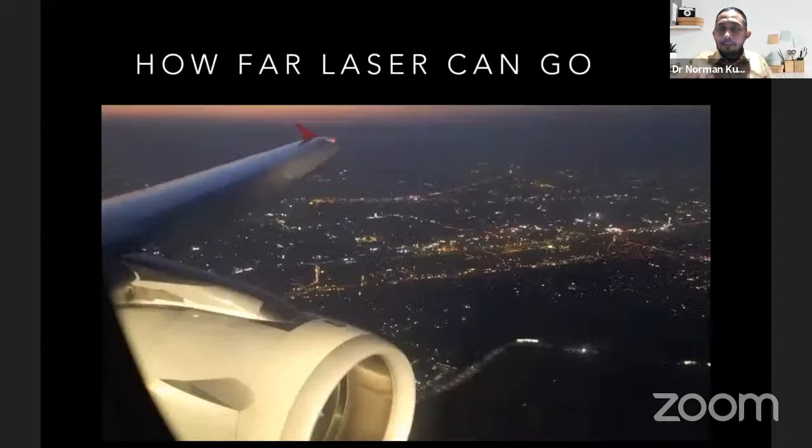The closer you get the laser to the soft tissue, the more penetration depth you have in the soft tissue. The more power, of course, the more penetration depth. More power and more distance also have a similar but different effect. That's why we need to understand the physical and bio interaction.